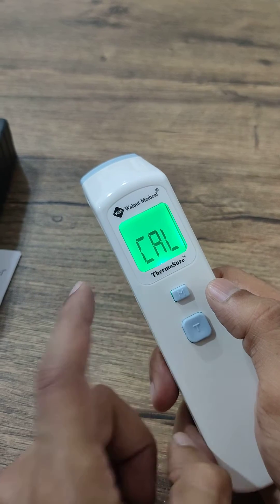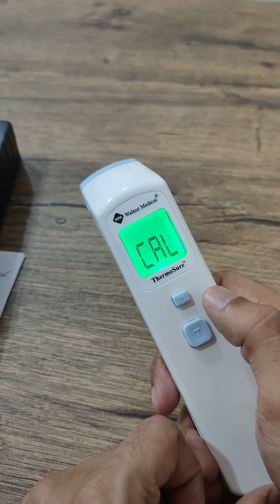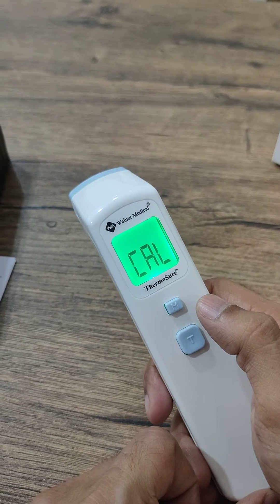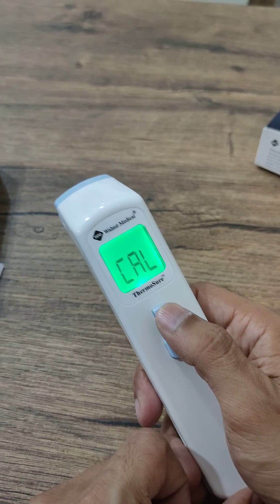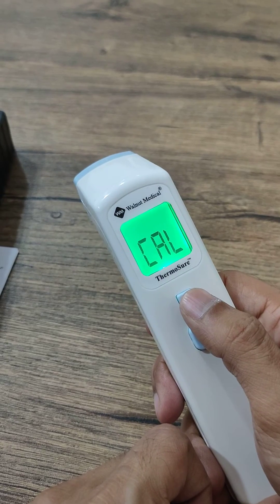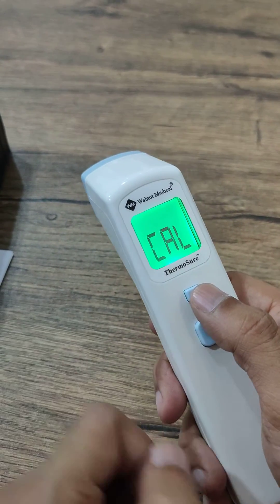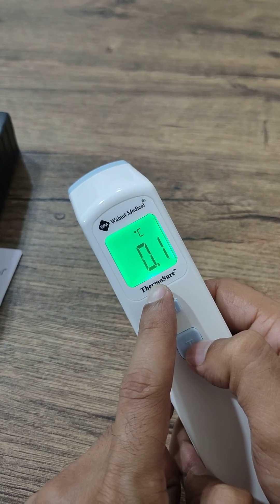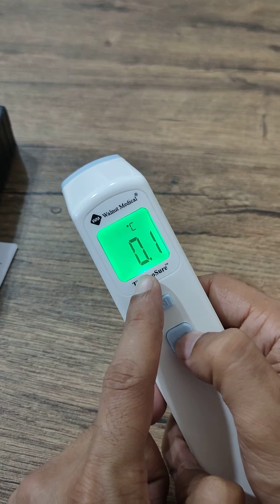Then we come to CAL mode. CAL mode is used to calibrate the Thermoshore yourself. If you think there is a differential between a digital thermometer and your forehead or body temperature, you can add that value using CAL mode.